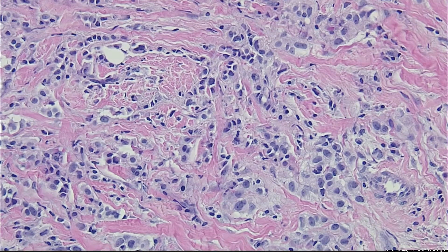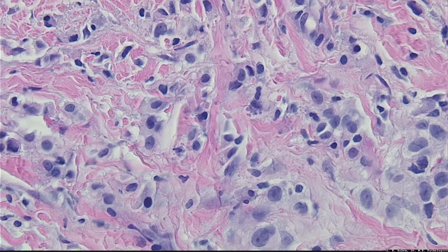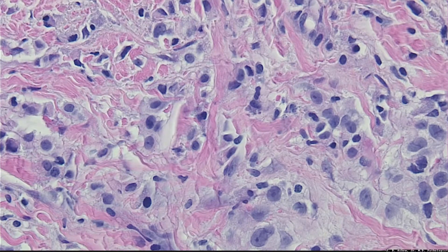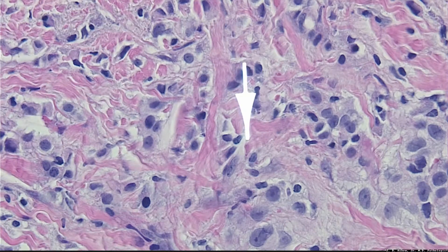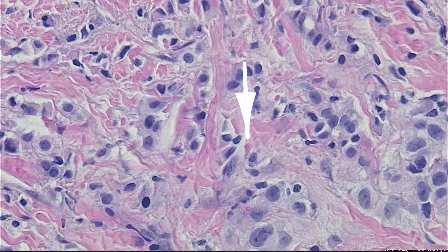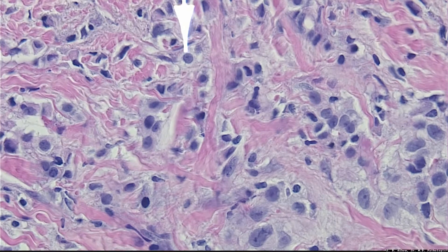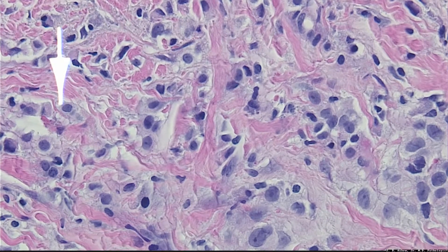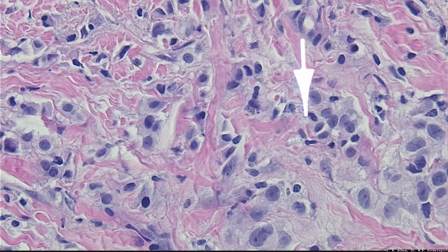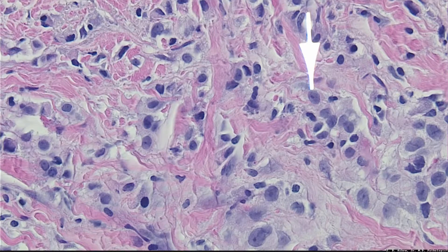What other imaging systems can't do is go to 40x, or 400 power. Look at the detail of these nuclei — you can see the cytoplasm, the nucleus, and nucleoli. We can turn on the arrow and move it around to demonstrate specific detail: here's a nucleus with a small nucleolus, here's a nucleus that's elongate, and other groups of cells we can point out. Everyone can see exactly what the pathologist is seeing at a remote location.